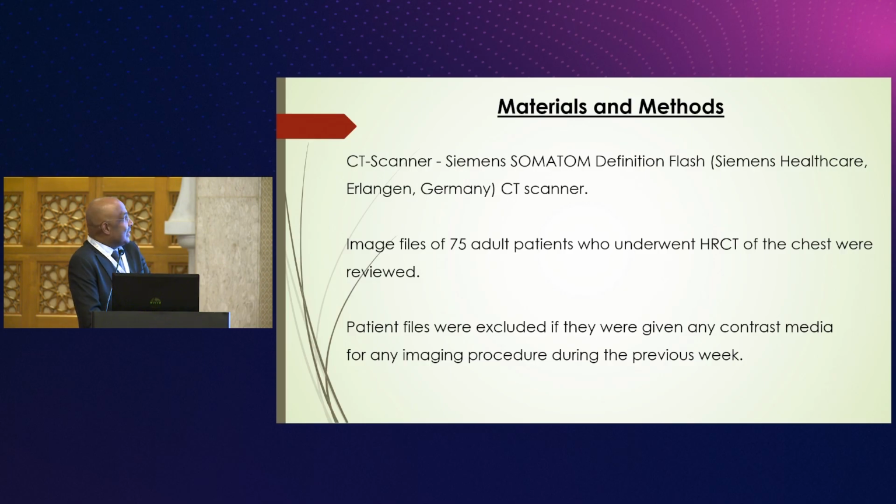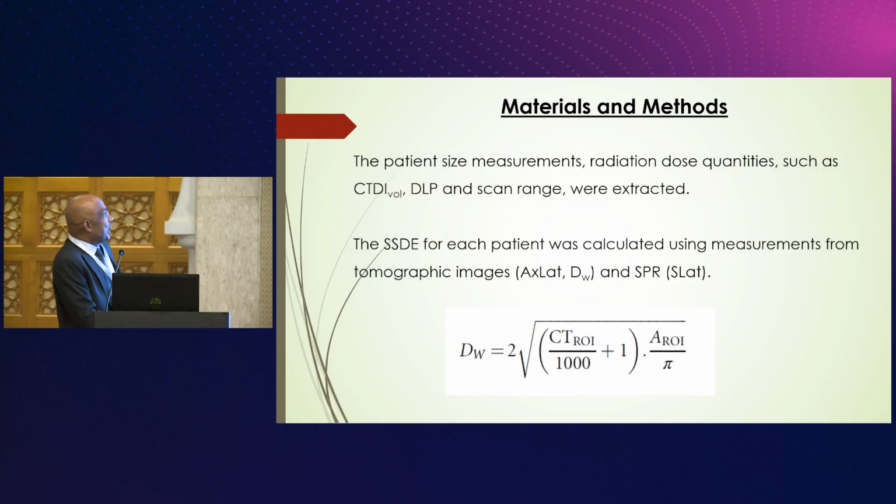So based on that, patient size measurements and radiation dose quantities, such as CTDI volume, DLP, and the scan range, were extracted from the image files.